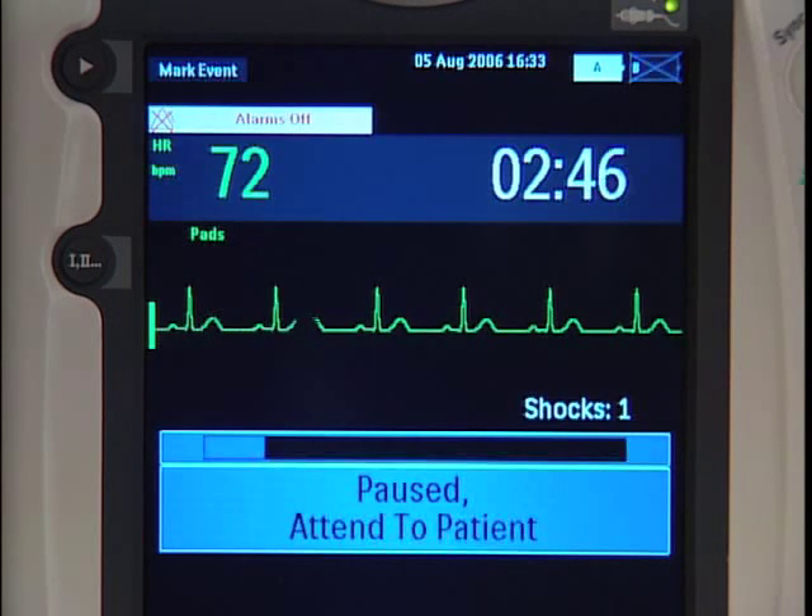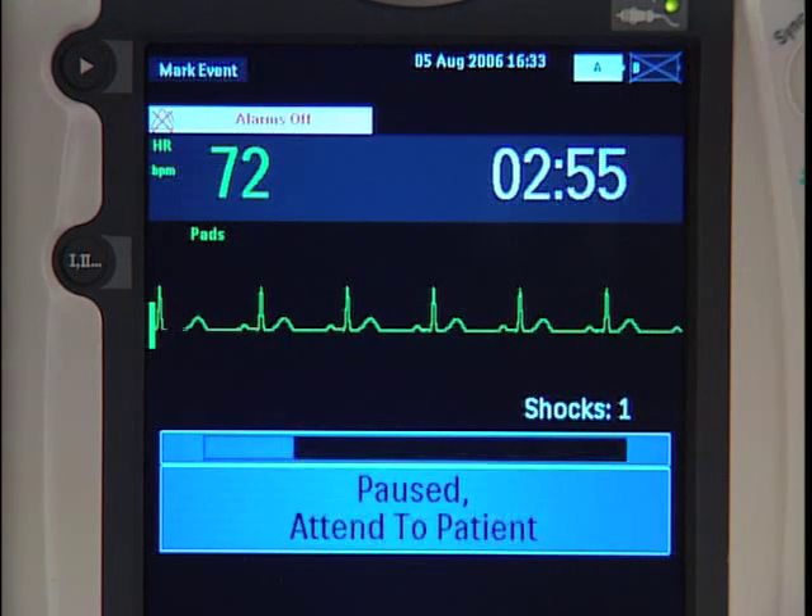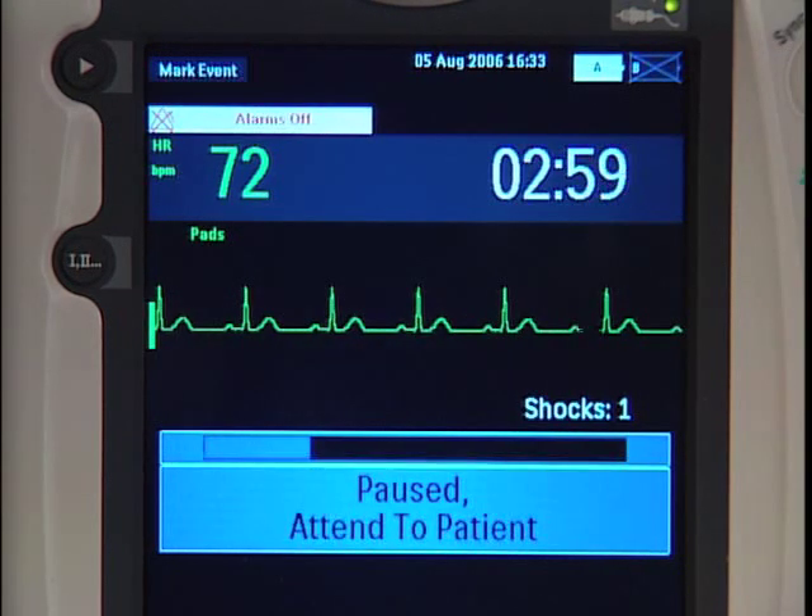The device prompts you: Paused. If needed, begin CPR. Analysis is suspended during the pause period, which you can configure for the recommended two minutes, during which time you can administer CPR.